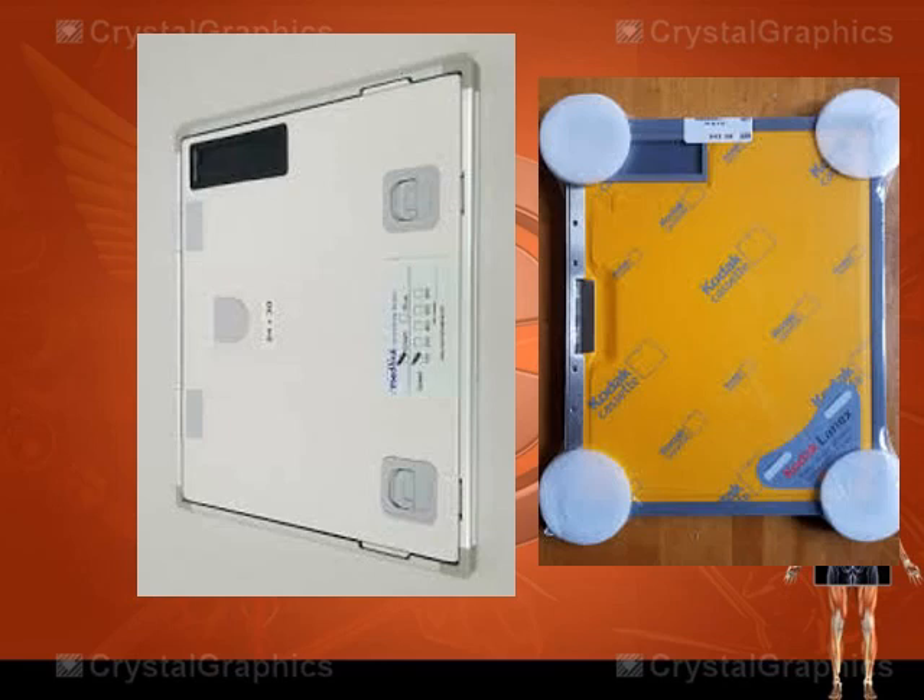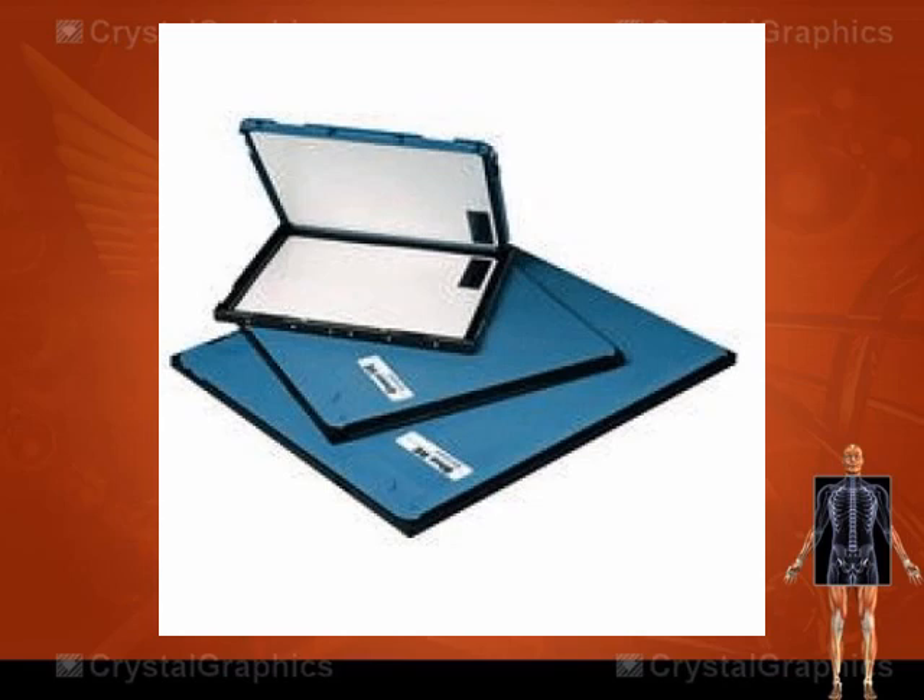The back part is made of magnesium or lead. We can also see the lead markers and the latch for opening and locking the cassette. In older types or brands of cassettes, hinges are visible. The felt gaskets are the black portions that ensure when the cassette is closed, light cannot enter and pre-expose the films.